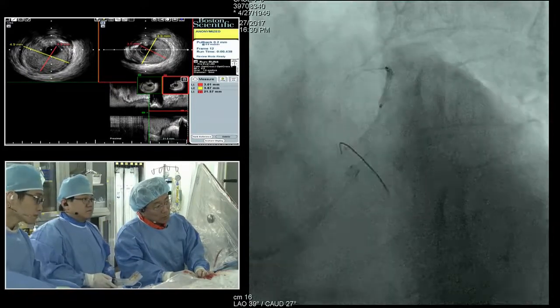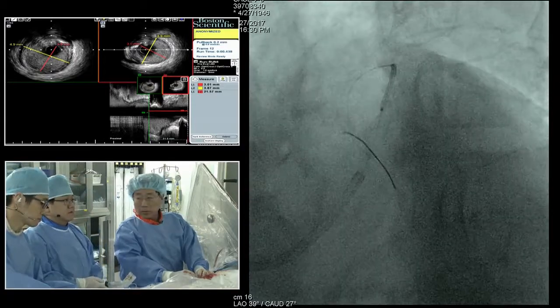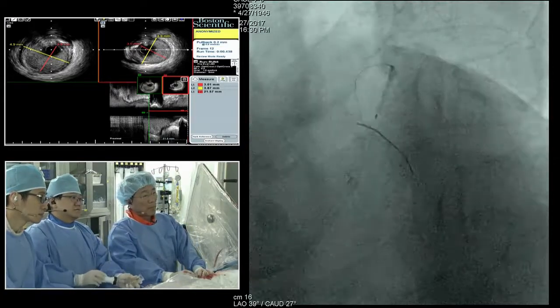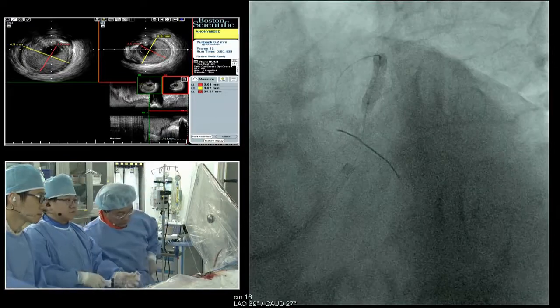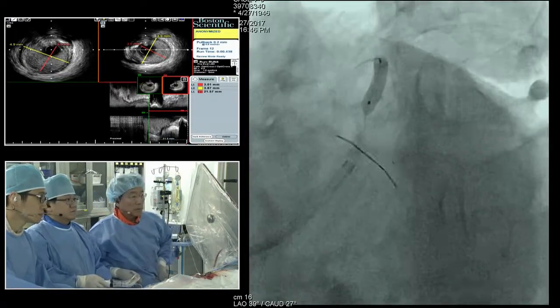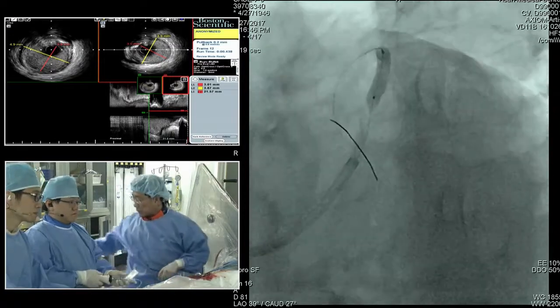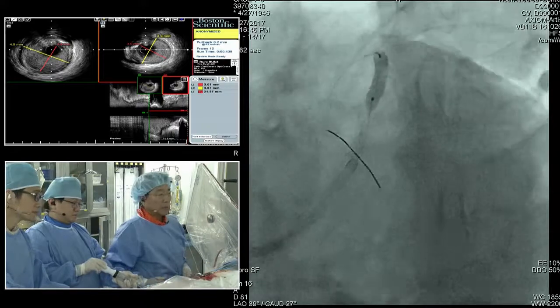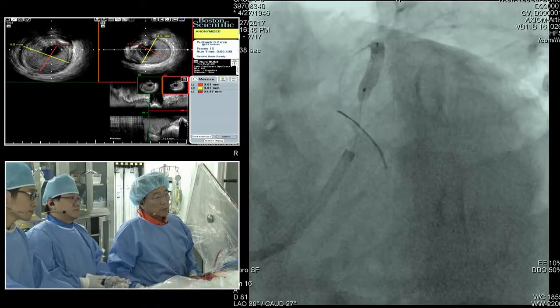1 millimeter. Pull the stent out. Test. Okay. Good, it's okay. Inflate. 10. Okay, 10, 12, 12. 3.6, 12, 13, 14. Why not 16? 16. The reason why is the vessel size itself is a pretty big one, so we are not too concerned.